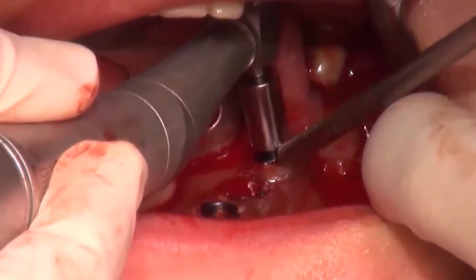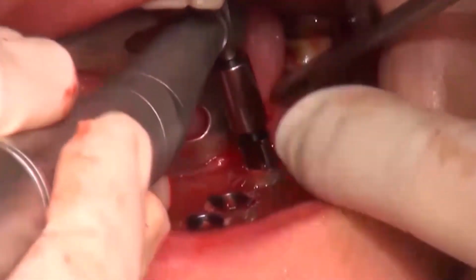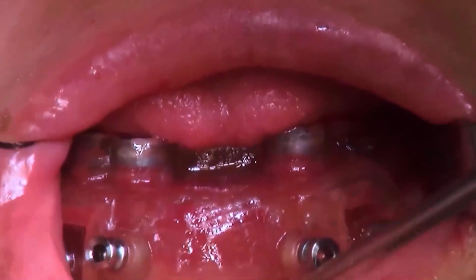All 6 implants had a strong initial stability, which is higher than 40 Newton centimeters.